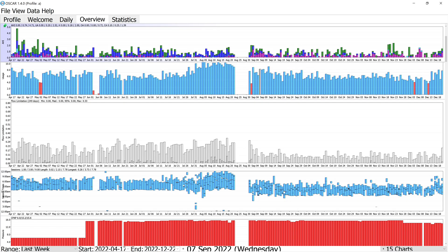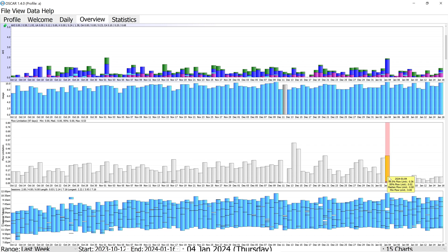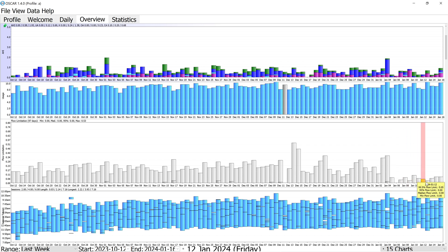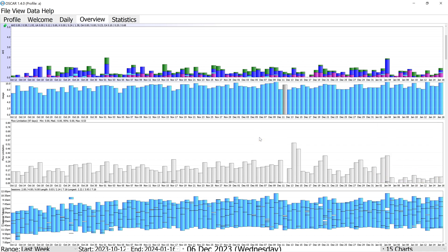Here's another example of a change in flow limitation. Do you see where things changed quite a bit? What happened right here to get flow limitation down to zero? That's not very common. And then all of these days — that was EPR two centimeters changed to EPR three centimeters.